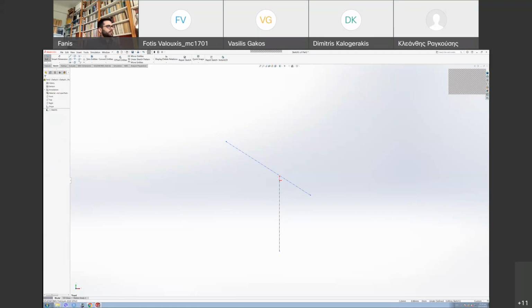Okay, I hope you know that, but a very helpful feature is to put a relationship between the different lines and points. So for example, if I choose this point here, I press the control key, you probably can see that, and I choose the line. I have this menu here and I can choose coincident. So make sure that this point is coincident with this line and this line can move along on this point, okay?